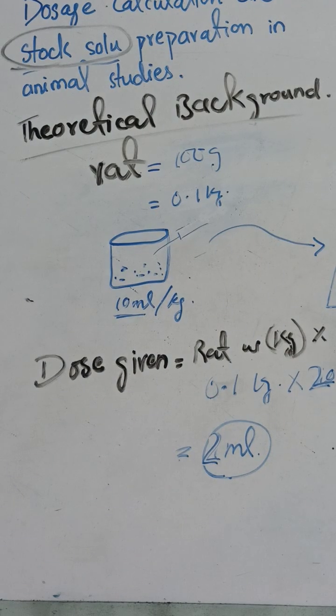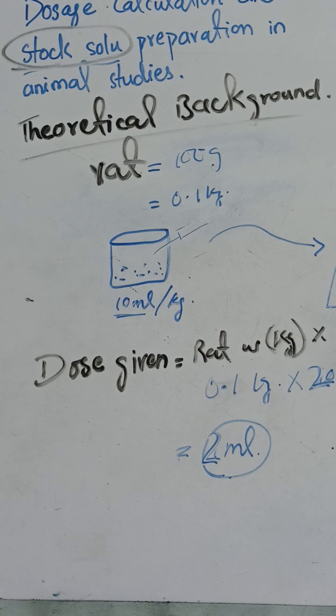This is the question that arises in our minds, because the rat is an animal that cannot ingest oral tablets or capsules. So that's why we have to make a solution of it to inject into the rat, so that our drug can be 100% bioavailable in the blood of the rat and can distribute normally, right? So that's why we cannot give oral drugs to him. We make solutions and then we inject it into the rat.